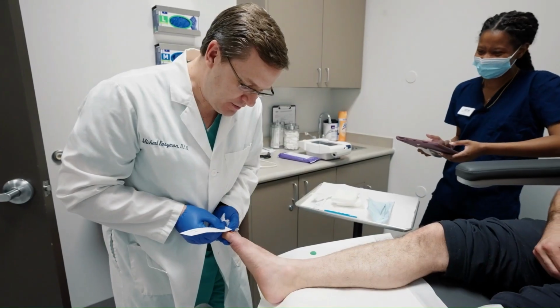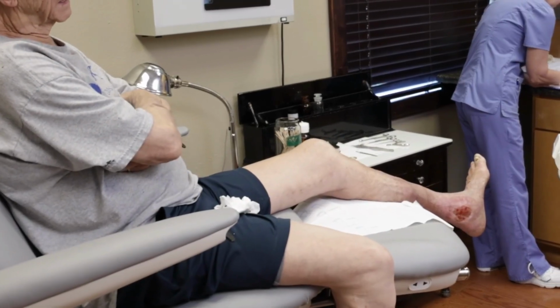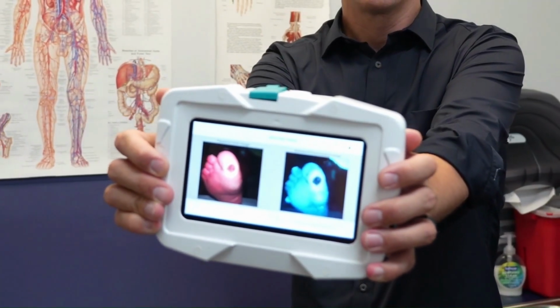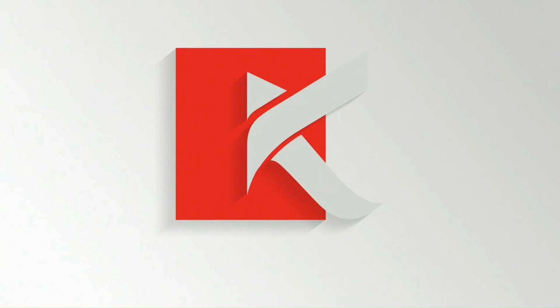Clinicians treating diabetic foot ulcers, venous ulcers, burns, amputation sites, and surgical sites will all appreciate the time and cost savings of using SnapshotGLO. Clinicians can build rapport, gain trust, and patient buy-in. See beneath the surface. Seeing is knowing.